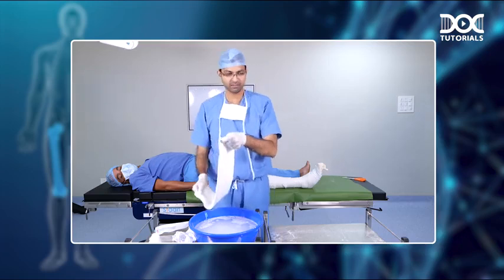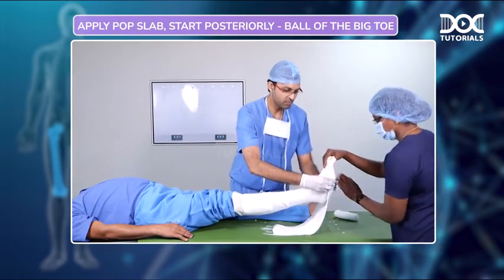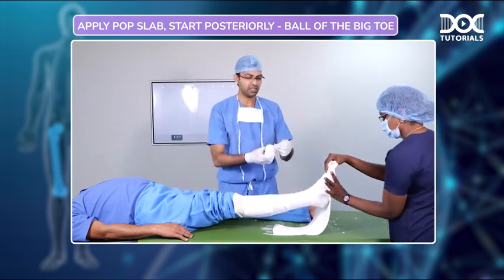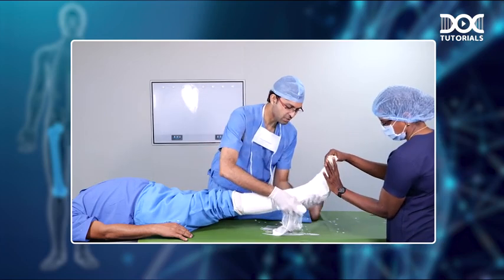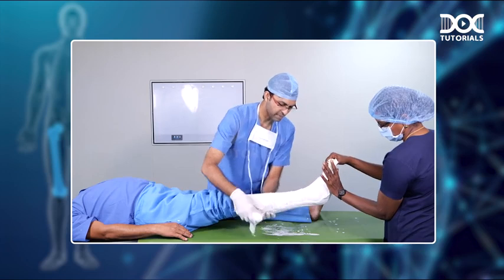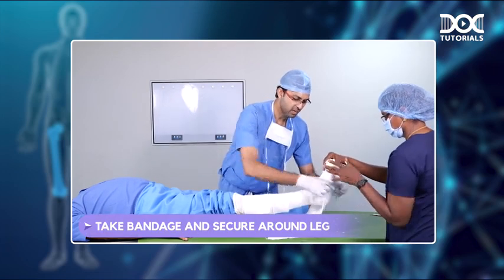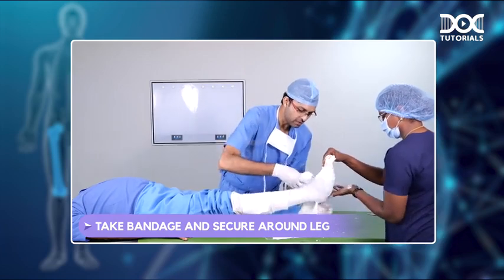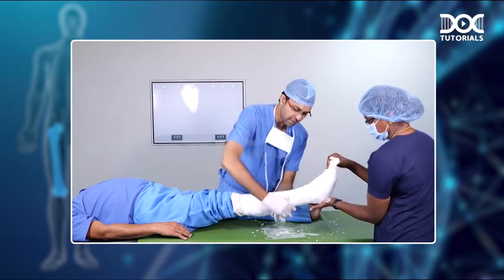Once you do that, you apply the POP slab like this posteriorly. Make sure it starts at the ball of the big toe and you gently massage it slowly so that it becomes in the shape of the leg. Once you do that, you take a bandage and securely tie it around the leg like this so that the POP slab gets fixed onto the leg.